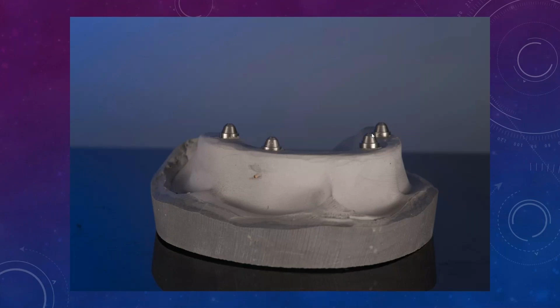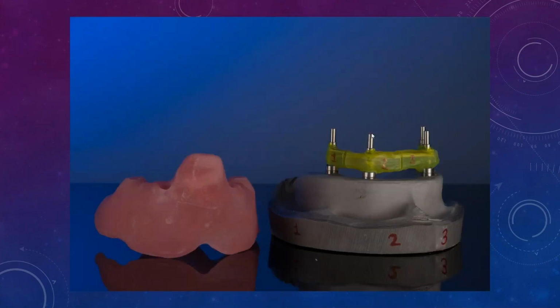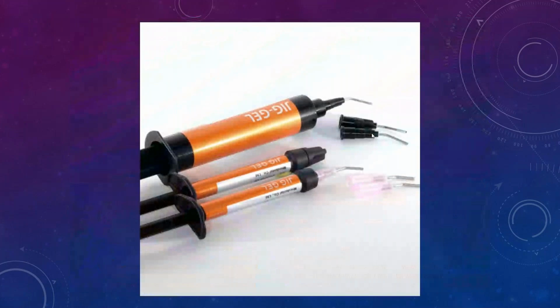So I'll use this initial impression. I'll make a little jig with some pattern resin and some floss, as you can see right there, and I'll slice it for them, and I'll mark it for them, and I'll make it in a custom tray. So all I have to do in the clinic is just put that in place and glue those pieces together, because I make them nice and thick. Because if you're doing it chair side, intraorally, it's very difficult to control the thickness a lot of times, okay?